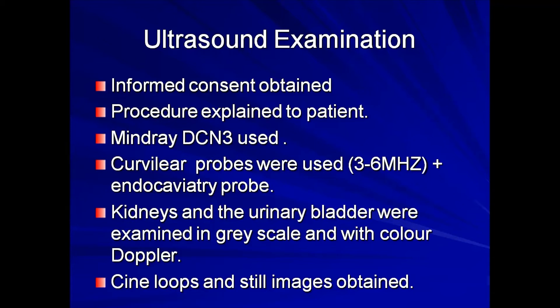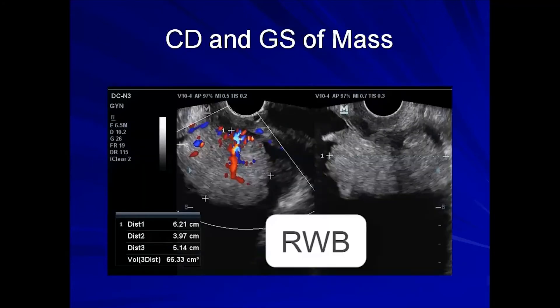The ultrasound exam used the Mindray DC-N3 from Shenzhen, China, with curvilinear probes of 3 to 6 MHz and an endocavity probe introduced rectally. Kidneys, ureters, and bladder were examined in grayscale and with color Doppler. Our first image shows a transverse section on the left and a longitudinal section on the right, which shows a hypoechoic mass with ill-defined margins.